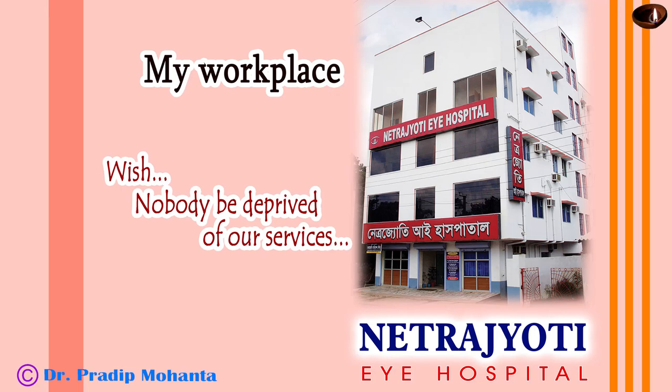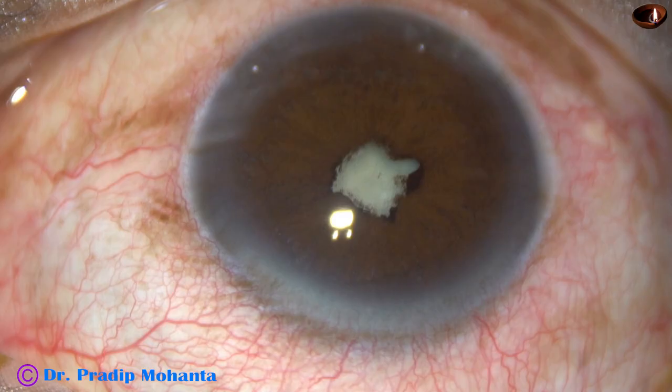Friends, welcome to my workplace at Ranaghat, West Bengal, India. This is an intumescent cataract with posterior synechia. Let us see how we can manage this case.